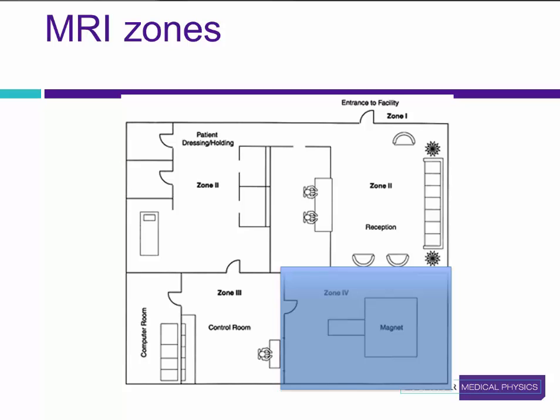As you can see, each of these zones is increasingly restrictive in the number of people. As such, you may have some restrictions, and it's up to you to talk to your supervisor to ensure you can remain safe while working in and around the MRI. If assistance is required in helping set up these various zones, Landauer Medical Physics can help you determine the proper layout and signage for your unique situation.